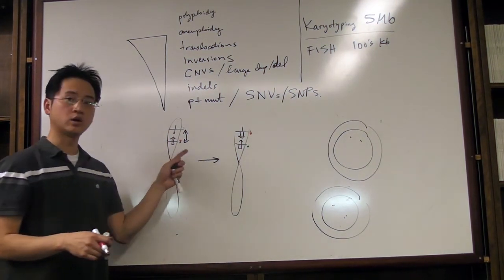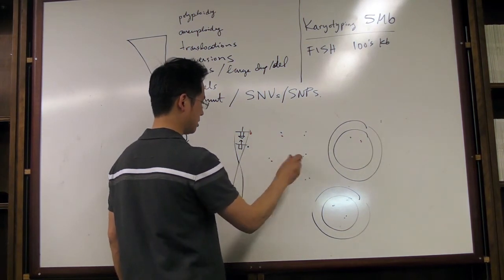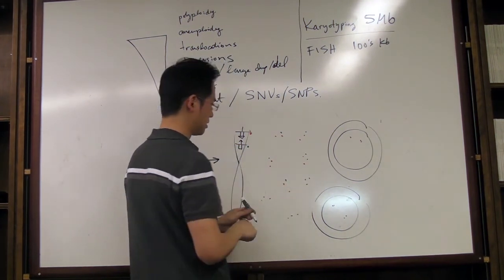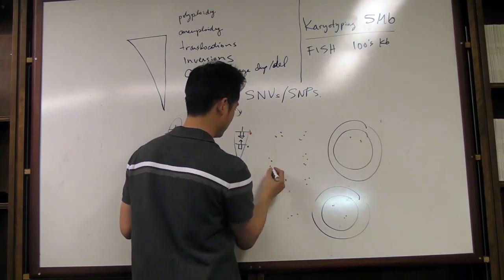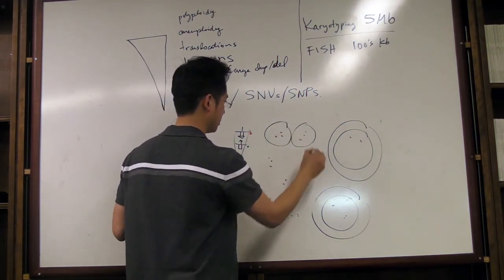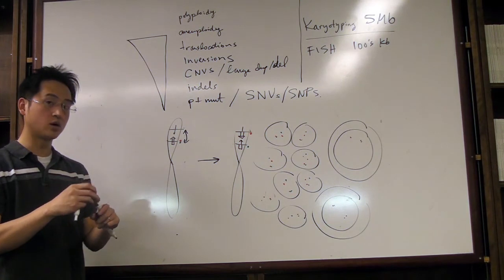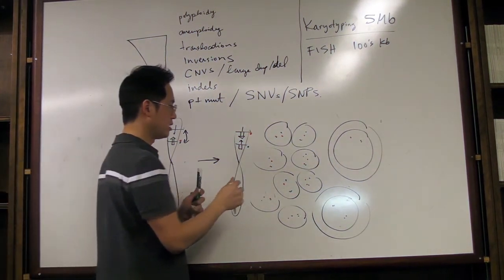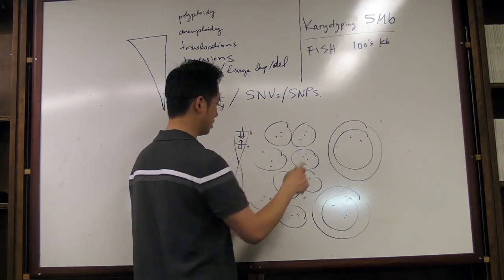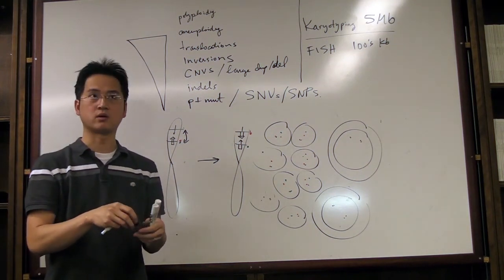But the thing is, this is an intramolecular event, right? So from cell to cell, you're going to see always something like that. So there you have positive cells around. And these are the individual nuclei. You see how they're kind of consistently apart? That's how you can tell that there's an intramolecular or intrachromosomal rearrangement. Whereas if it is a true translocation with 2 chromosomes, you'll see them kind of variably apart. Sometimes far, sometimes close, sometimes midway in between, all kinds of flavors because there are 2 independent chromosomes or derivatives that are occurring.